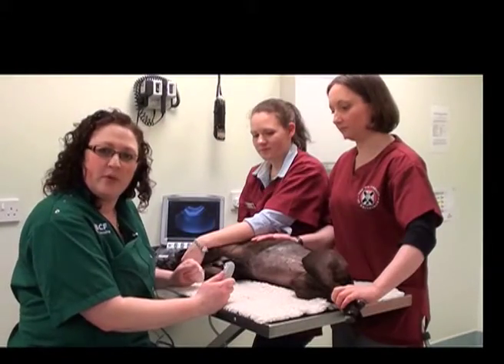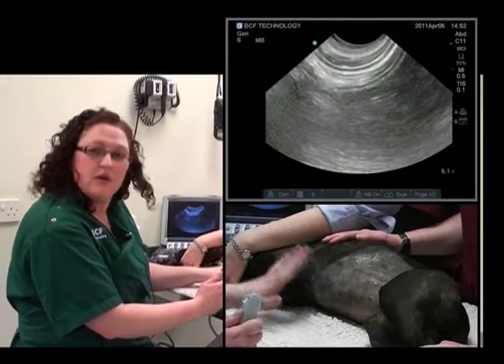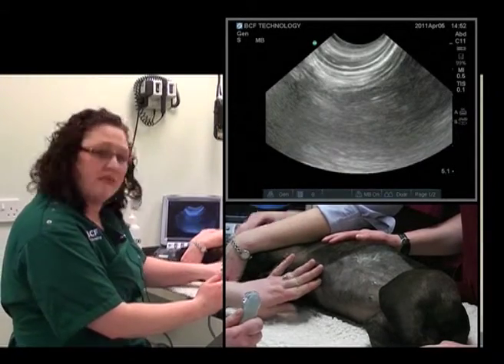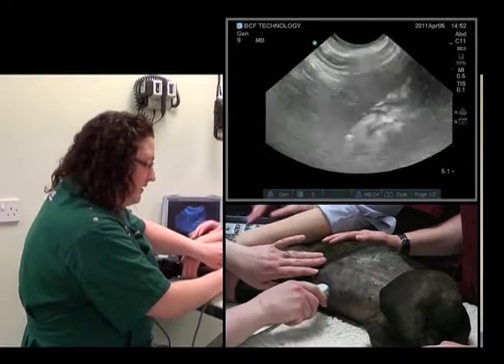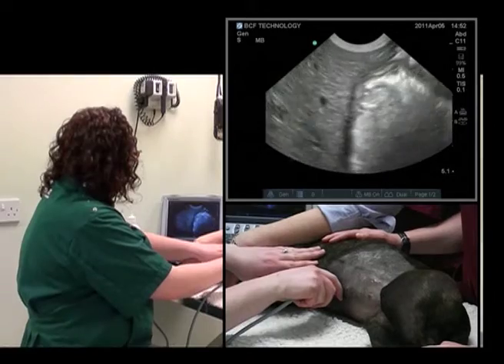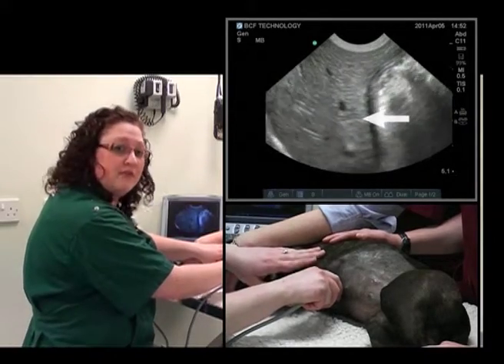The first organ that we will identify is the liver. It's important to start with an organ that you feel confident in finding in any animal — one that is fixed — and the liver suits this job very well. We'll start at the xiphisternum in the sagittal plane, going right in the midline, and the liver is found immediately.